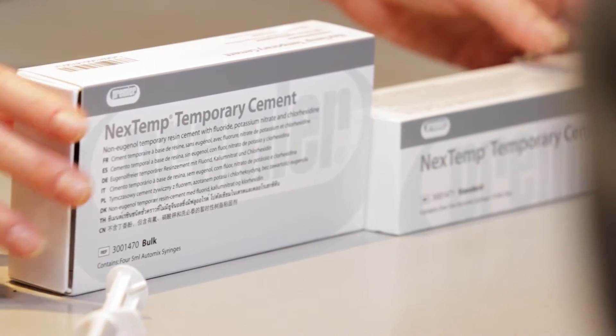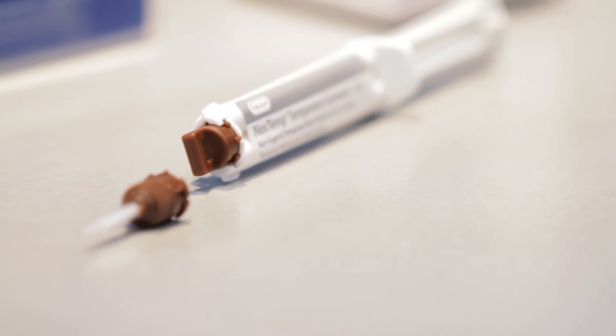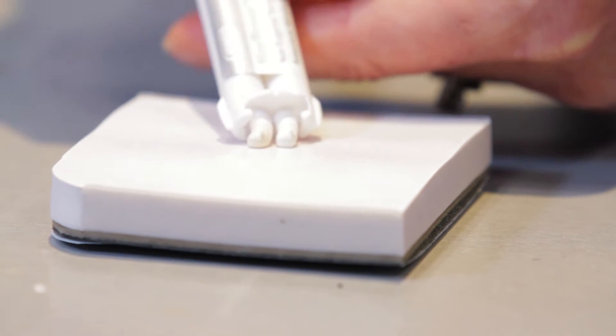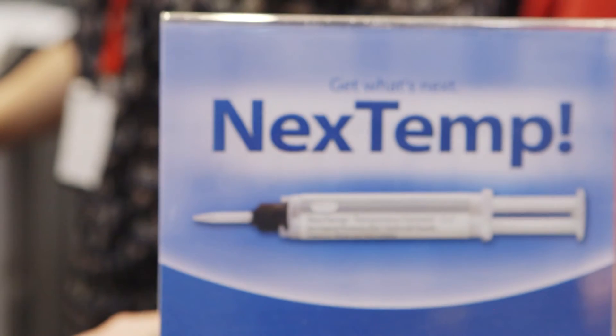What's especially nice about NextTemp is that it provides firm retention to your temporary crowns. The excess is easily removed in a gel stage, and when you want to remove the temporary, the cement stays within the temporary and pulls nicely away from your preparation.